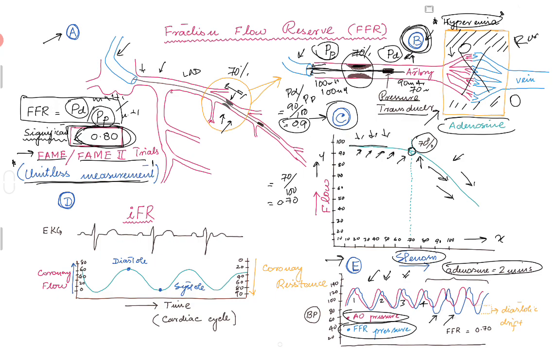What I want you to look at is this slope down here. This is called the diastolic drift. So basically, the distal pressure measured by this piezoelectric crystal on the wire, most of the time we will see this diastolic pressure will go down, and that makes sense because we know that the coronary circulation is dependent on the diastole. So the coronary fills during that diastolic phase of the heart cycle.